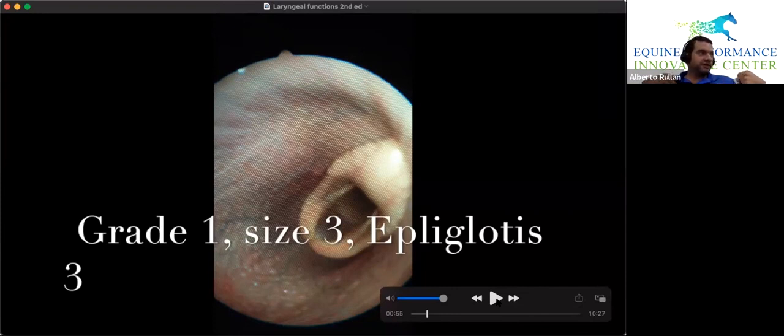In the old scale, which is most common that we use at the sales, a grade 2B meets condition of sales at both. But in OBS, in the new scale, a grade 3 does not make condition of sales. You see how it gets all confusing versus grade 1, grade 2, grade 3. So what we've done at the sales, as an unspoken, unwritten rule, is that we still use the old scale.